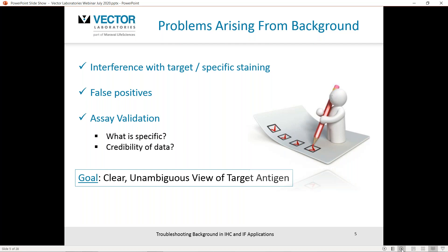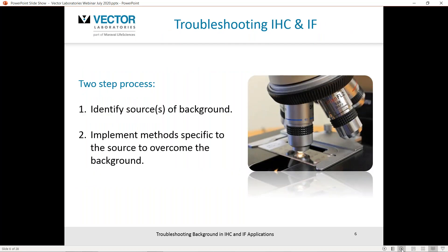The goal in immunohistochemistry and immunofluorescence is clear, unambiguous views of the target antigen you're looking for. So if you are encountering background, you want to undertake some troubleshooting — a two-step process: identify the source or sources of background, and once identified, implement methods specific to that source to overcome the background staining.